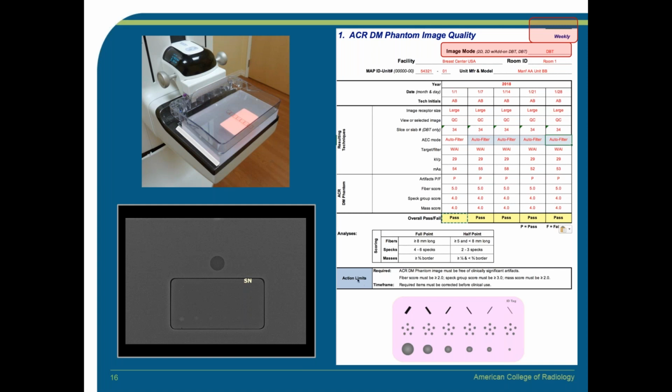So you'll notice that there's no CNR, there's no SNR, there's no baselines. You just have to meet minimum criteria. So this is a weekly Phantom. This is probably the biggest, I guess you'd say, change, because A, you have a new Phantom, and B, you are no longer subtracting for artifacts. So those are the two things. And then your pass-fail criteria is slightly changed from 433 to 232. So that will be easy to learn.